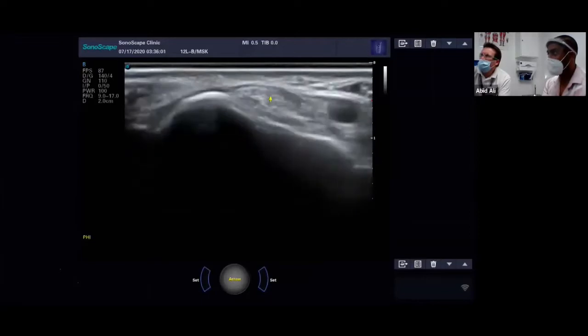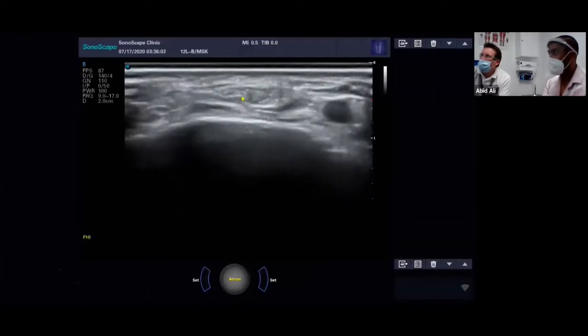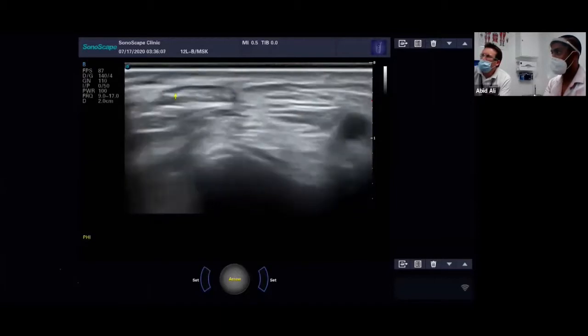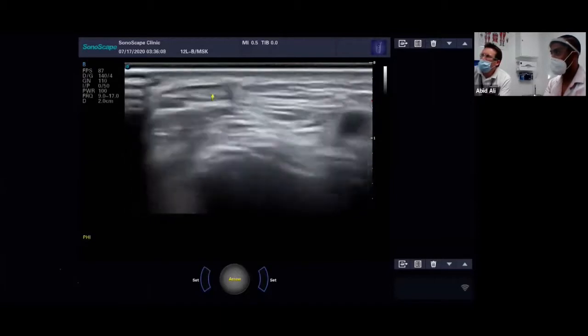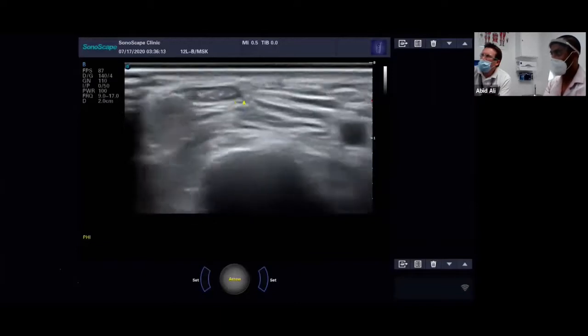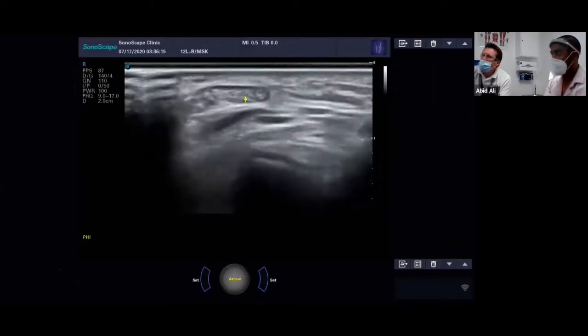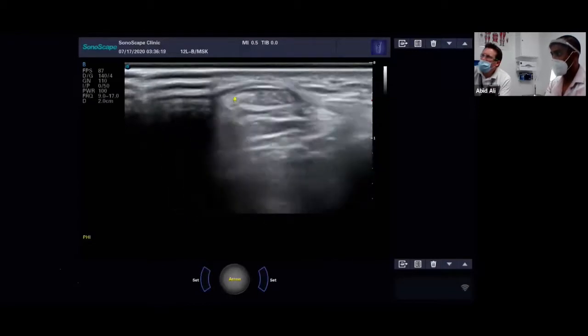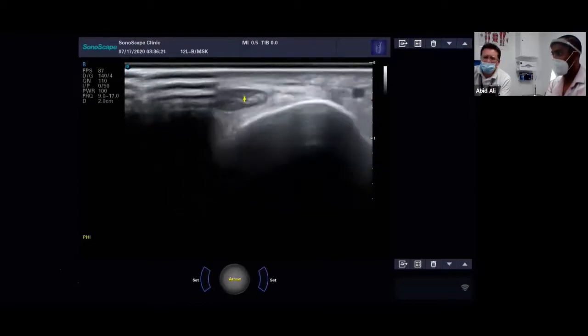And can you see how I'm just moving proximally to distally and just trying to keep that in view? So keep your eye on the tendon in the middle as I move it around. And if you start to see it veering off medially or laterally, you just try to bring it back to the centre of your image by adjusting the probe. So you can see there it's moving off. So I'm just going to move along with it because, of course, it doesn't follow a nice straight line.